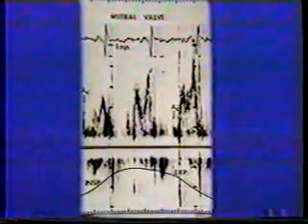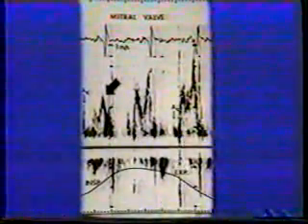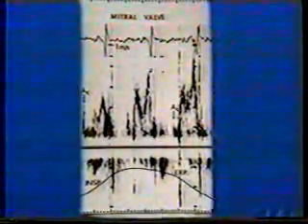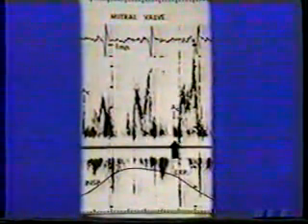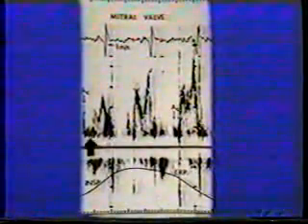This is a pulsed wave Doppler profile of left ventricular inflow from a patient with tamponade. This illustrates the decrease in mitral velocity with inspiration compared to expiration. The abbreviation AC stands for aortic closure. The isovolumic relaxation time for patients with tamponade is lengthened with inspiration compared to expiration. The reduction in diastolic filling gradient with inspiration causes the mitral valve to open later, and this is what prolongs the IVRT.